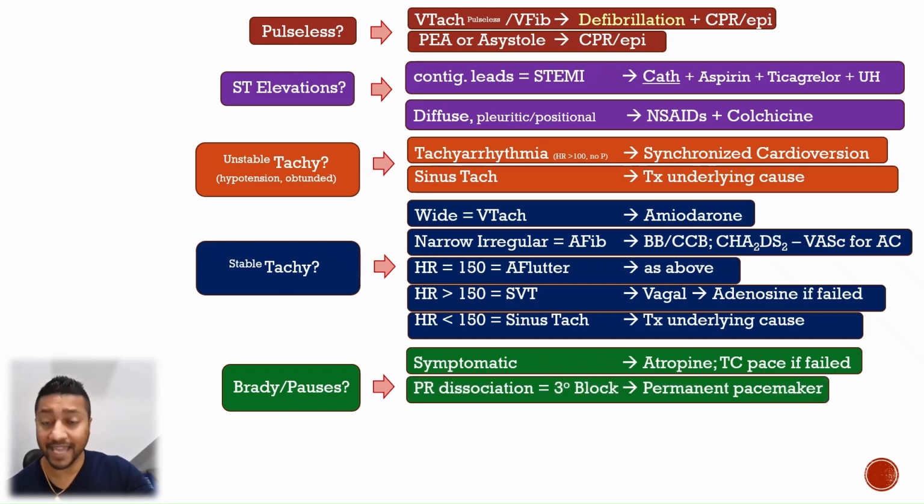Meanwhile, if I have an asymptomatic patient, then I can ask myself, all right, which of the bradycardias or possibilities of bradycardias could I be dealing with?